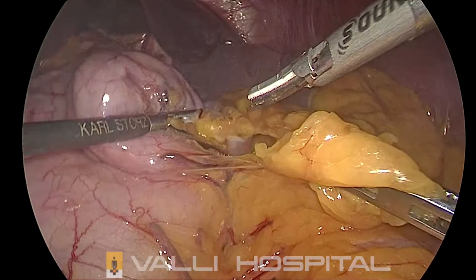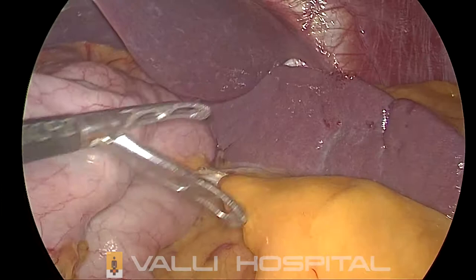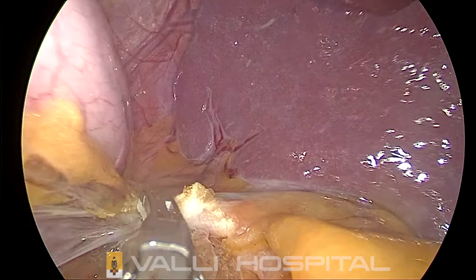Dividing the short gastrics, you have to see underneath. The blood vessels are better seen posteriorly rather than anteriorly. So take the camera down and then divide. Now I am close to the fundus. When you go closer to the fundus, the assistant has to hold the posterior wall and the surgeon has to hold the anterior wall. Sometimes there will not be a gap between the stomach and the spleen.